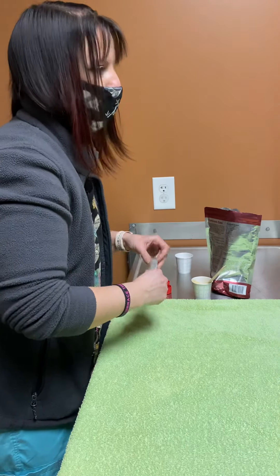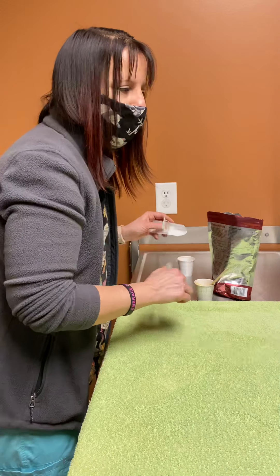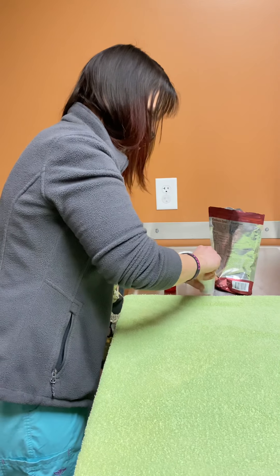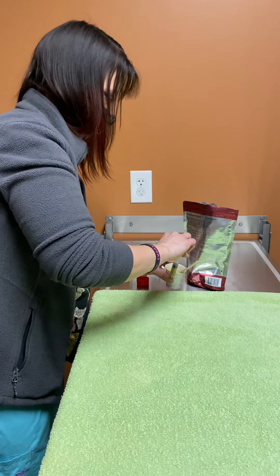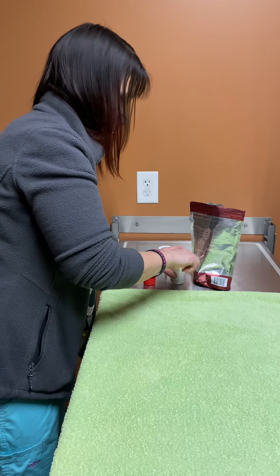We usually will send you home with some kind of an oral syringe or a syringe with a bigger tip, and we'll give you the amounts for how much you have to feed. We're just going to do a little bit.